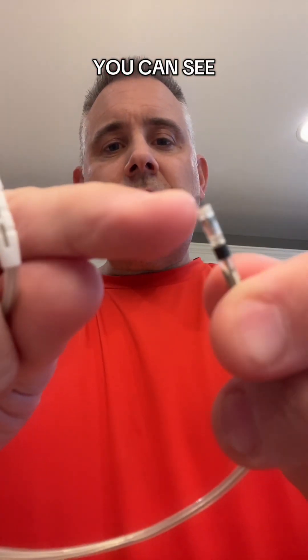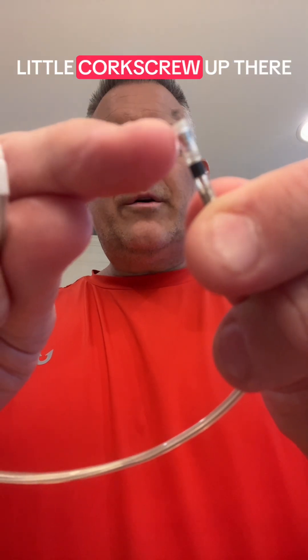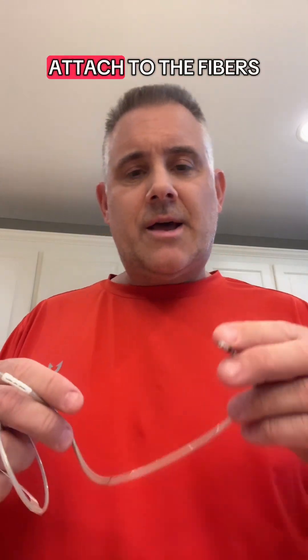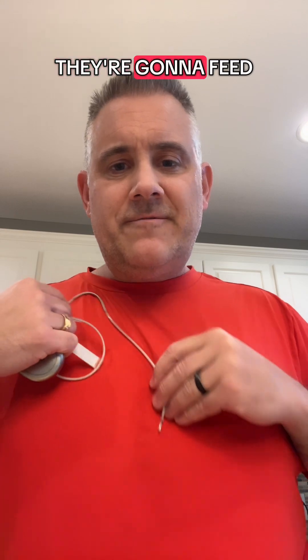This lead — if you can see right up here — has a little corkscrew, and that's what gets screwed into your heart. Other leads have little paddles that attach to the fibrous tissue of the heart. They're going to feed this into your heart and attach it to the heart wall. That's secure enough to hold it into a beating heart.